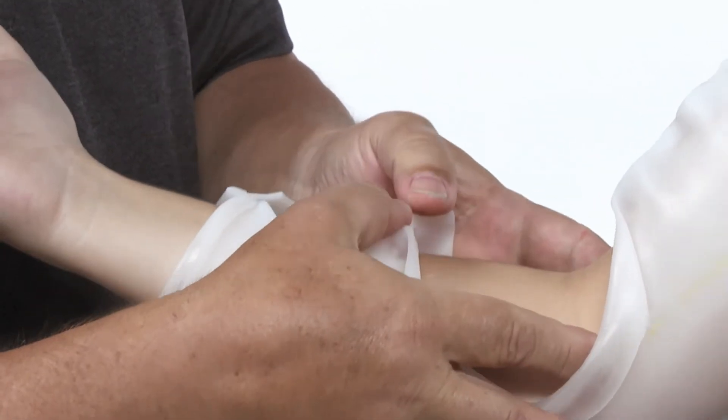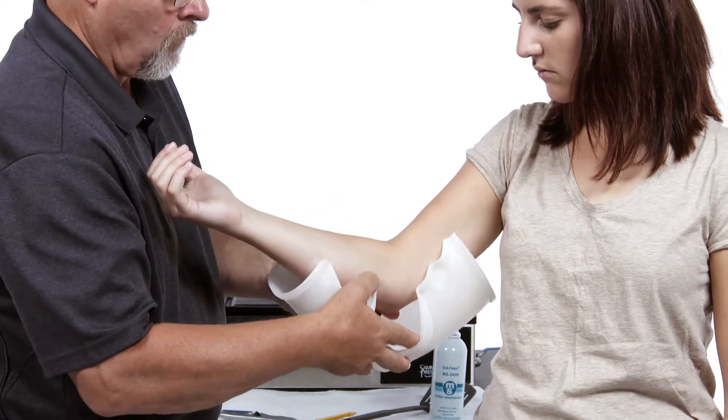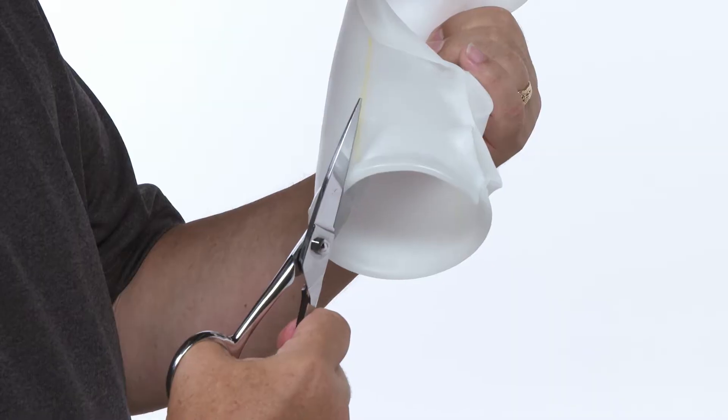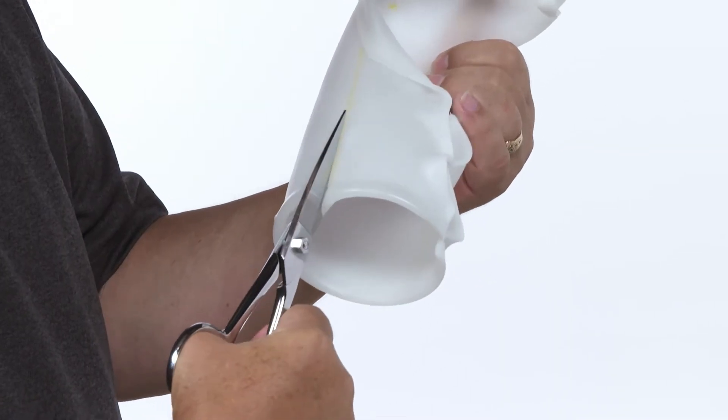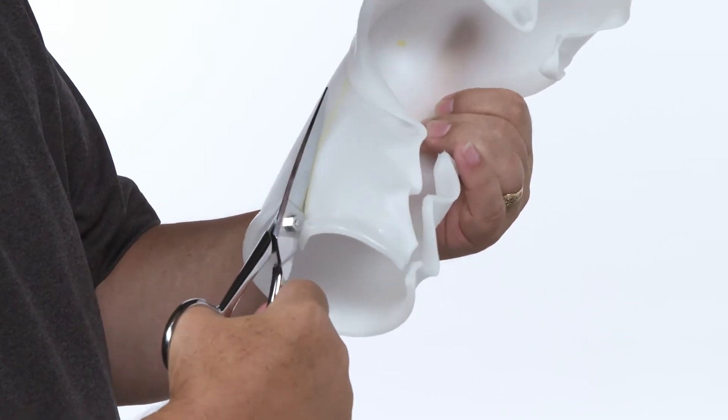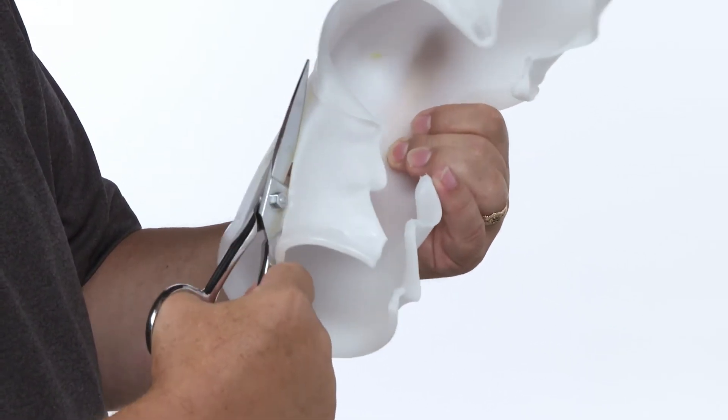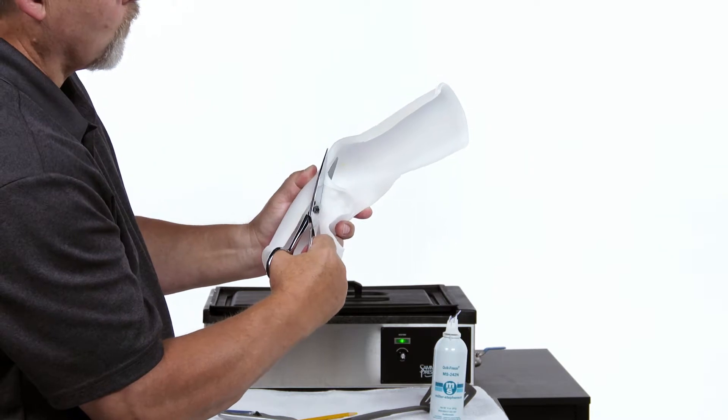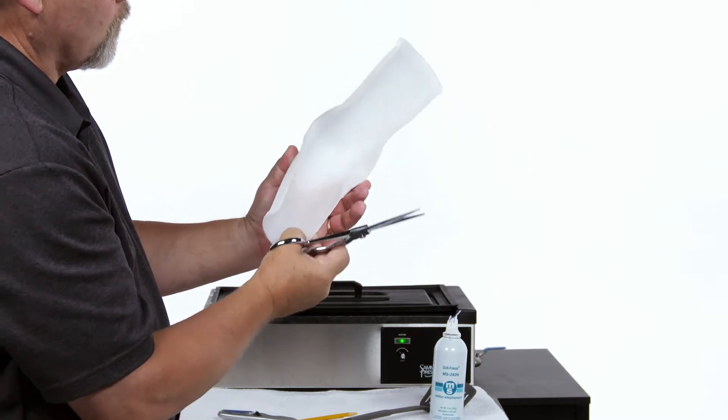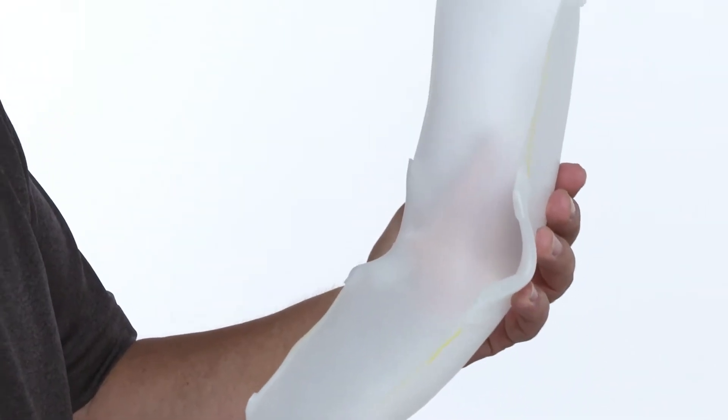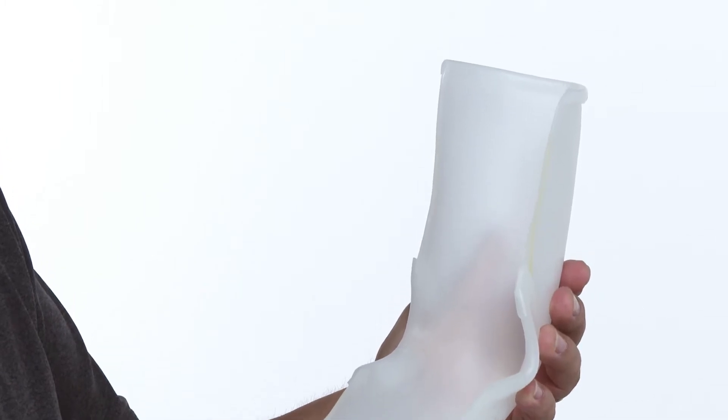Pop open the areas of material that have been pinched together. Remove the orthotic and immediately cut your trim lines. If the trim lines are cut while the inside of the material is still warm, the edges will seal themselves and you will not have to perform any further edge finishing. Otherwise, use an open palm to smooth the edges.